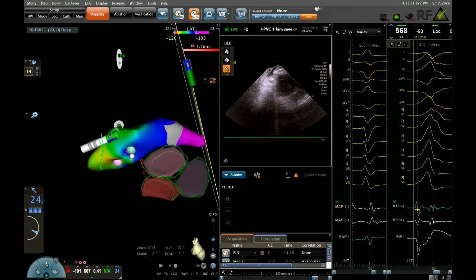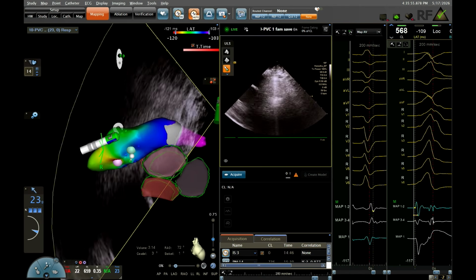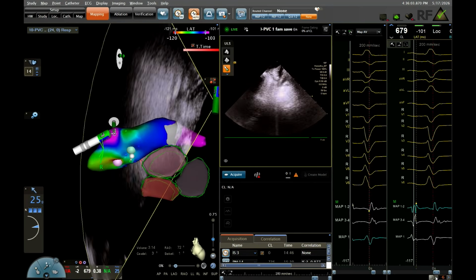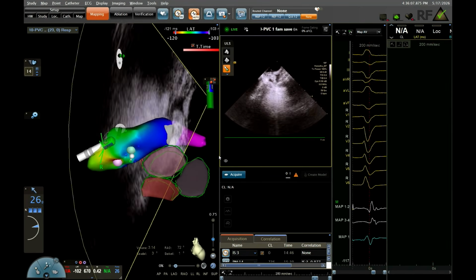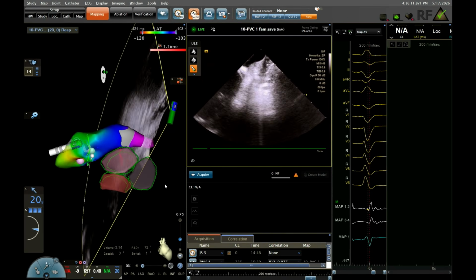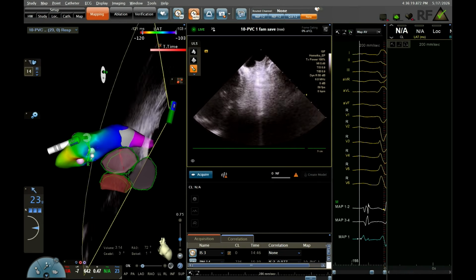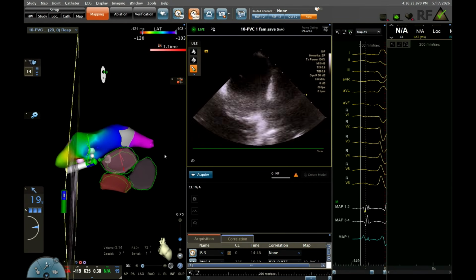So with intracardiac echo, I'm going to follow myself to where that tip is, okay? And I'm going to show it to you. Make the echo bigger, please, and turn it around for me. So as you come back, it becomes more difficult to see it because now you have a lot of fat. So because our friend, the left atrial appendage, was there, we did a transseptal.